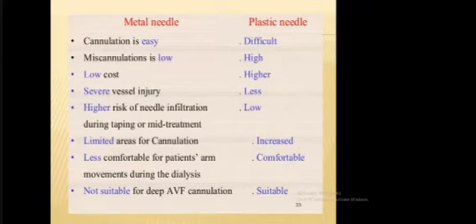With the plastic needle, cannulation is very difficult and miscannulation is very high. The cost is higher. The vessel injury is less, the risk of infiltration is also less, and it is suitable for deep AVF cannulation.